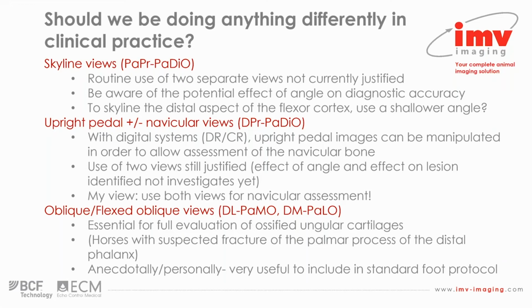For upright pedal and navicular views, with modern digital systems, upright pedal views or images do appear to be able to be manipulated in order to allow good assessment of the navicular bone. However, I think the use of two views is still justified because the effect of angle was not assessed in this study, and also the effect on lesion identification or the diagnostic accuracy was not investigated either.